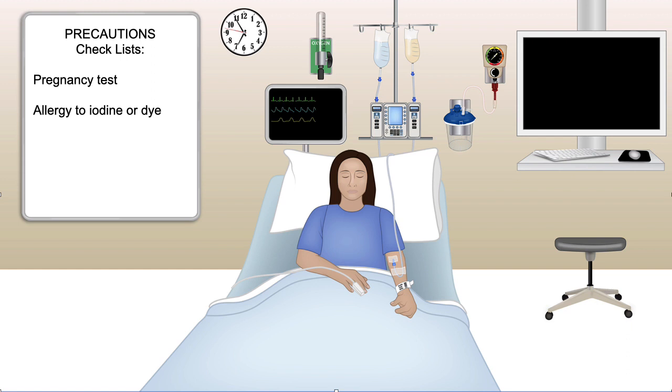Another risk is if you cut the sphincter, there's a risk of bleeding. So it's important to check the blood counts and the coagulation profile with PT and PTT. Also, in older patients and in anybody, it's important to check if they have a pacemaker or a defibrillator, especially if you're planning to do any electrosurgery and cutting the sphincter. That is important to keep in mind.